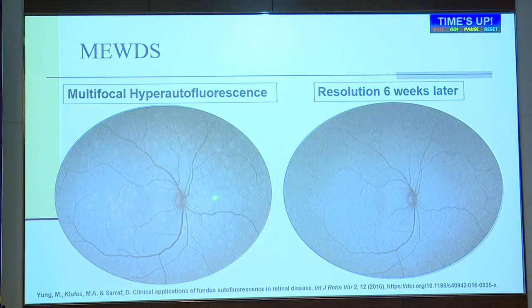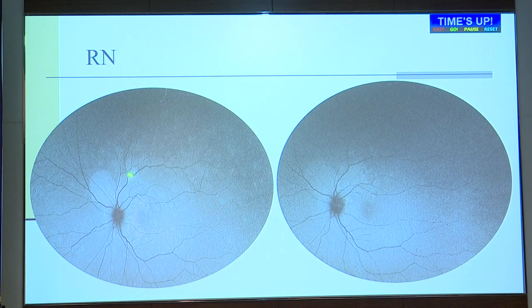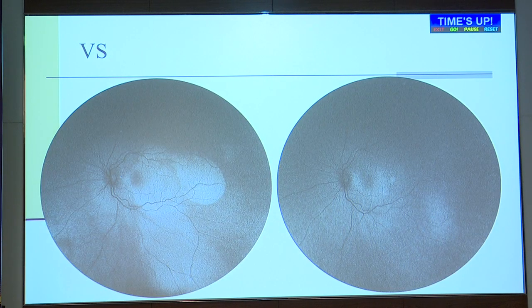Another patient. Then multifocal choroiditis. Before treatment, after treatment, you can see all these choroiditis lesions here. VKH, you can see, this is literally like doing a fluorescent angiogram. You can see all these areas of exudative RD, and this is post-treatment. Another patient of VKH, pre and post.